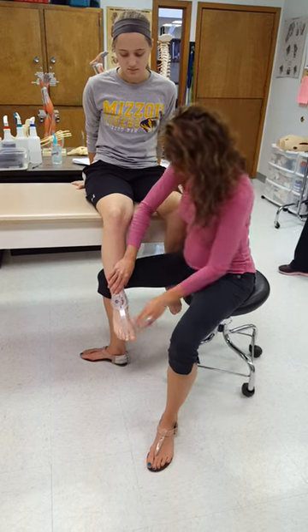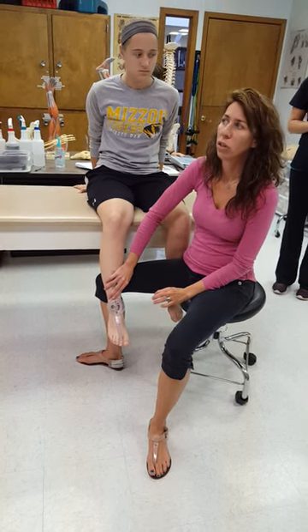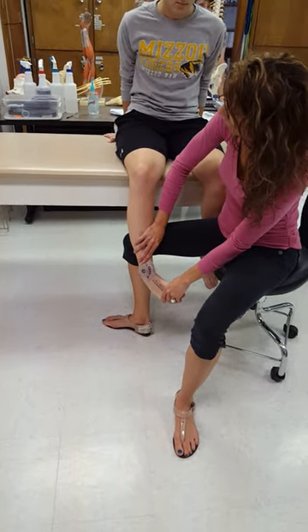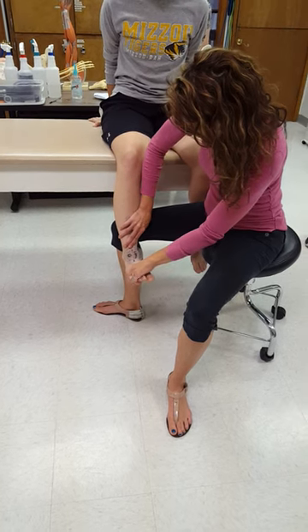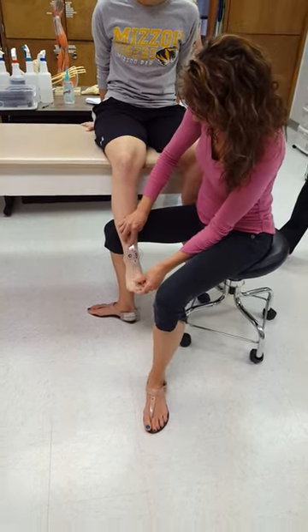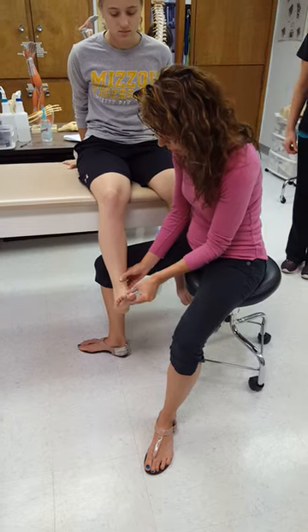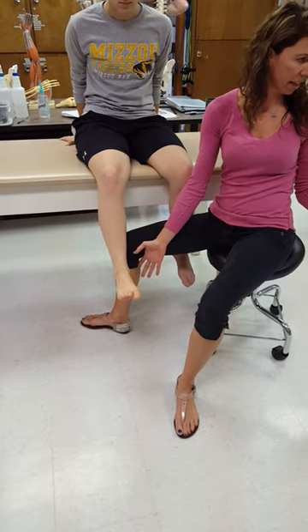One thing students forget is to get the ankle in neutral dorsiflexion/plantar flexion before doing inversion. If you allow her to go all the way into plantar flexion, she's going to have a lot more movement than if you put her in neutral and isolate inversion. You don't have to measure neutral precisely — just eye it. Make sure they're not really dorsiflexing or plantar flexing; they're pretty much at a 90-degree angle.